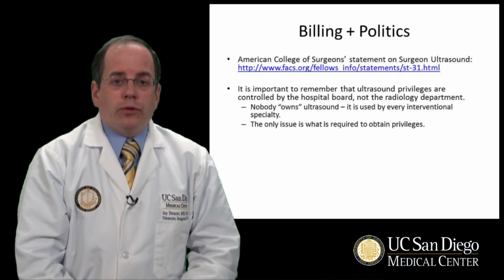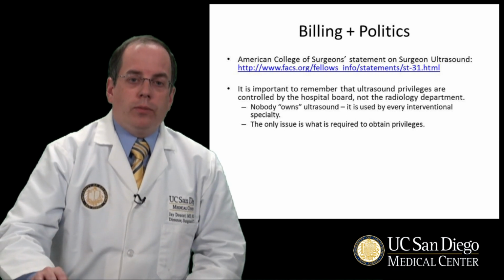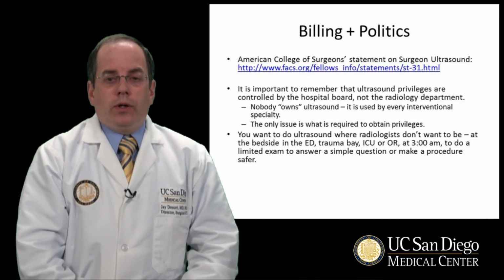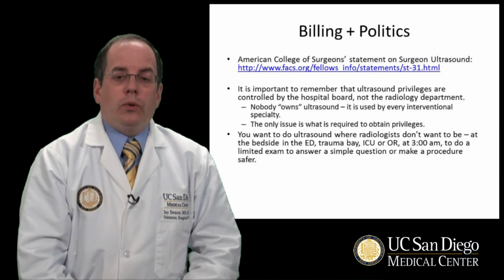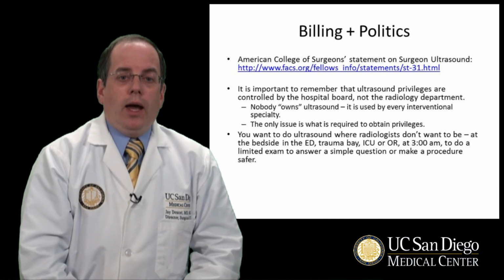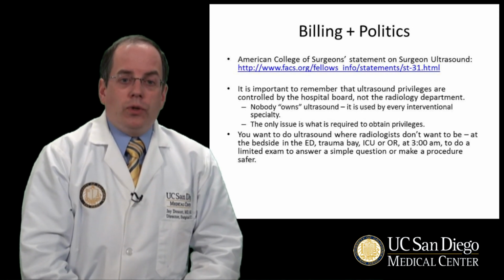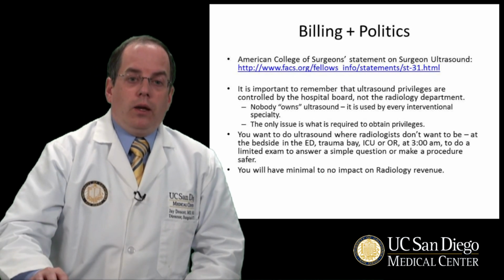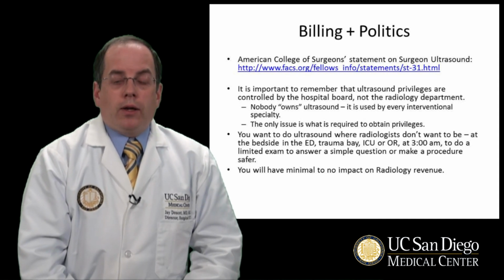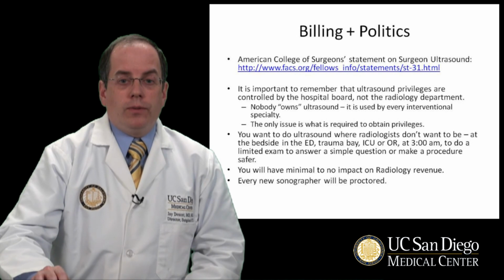It's used by every specialty, and the only issue within a facility is what actually is required to obtain ultrasound privileges. It's important that in having discussions about starting ultrasound programs, you talk about the fact that you want to do ultrasound where radiologists don't want to be at the bedside in the emergency department or the trauma bay or the ICU or in the operating room at 3 o'clock in the morning just to do a limited exam to answer a simple question and to make a procedure safer. You're going to have minimal to no impact on radiology revenue because you won't be billing the same types of codes that the radiologists do.